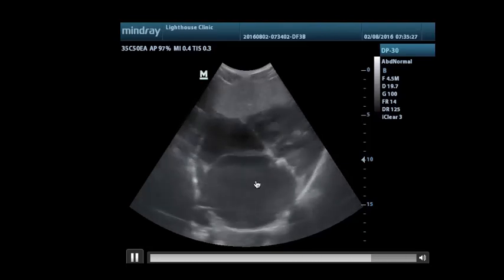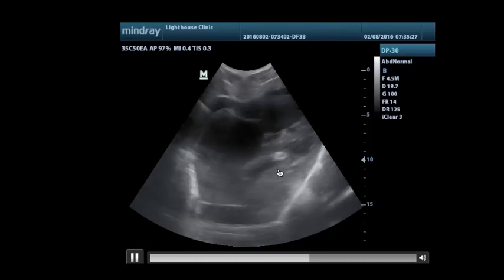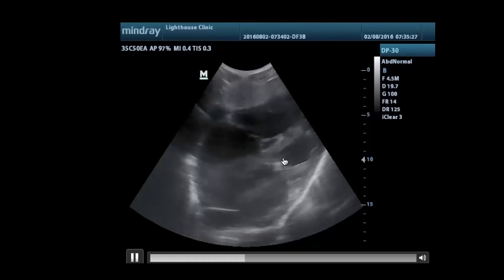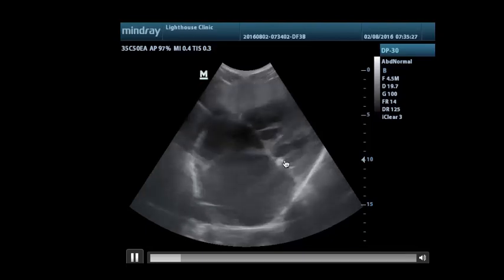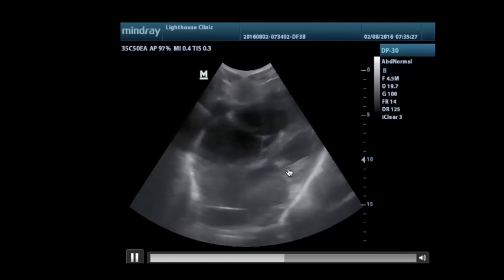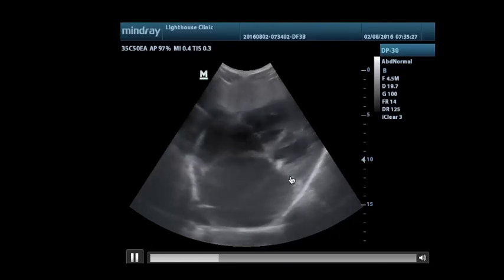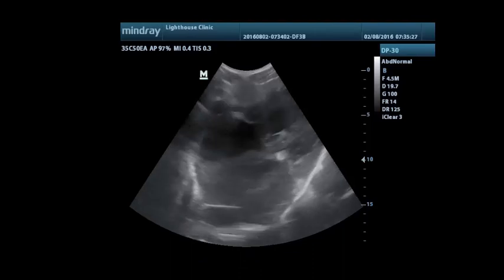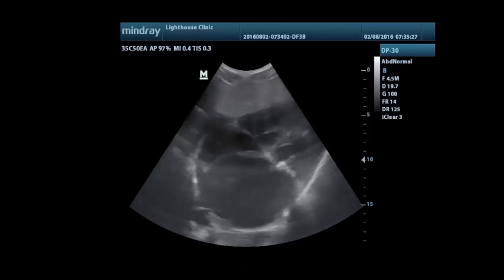Well, it is again a question of pressure building up and dilating it, and you can already guess that here this is the mitral valve between the two cardiac chambers, and that is thickened and stenotic. When it is nicely visible, you see that it is round and doming almost. So that is the underlying problem here. There is a mitral valve stenosis.